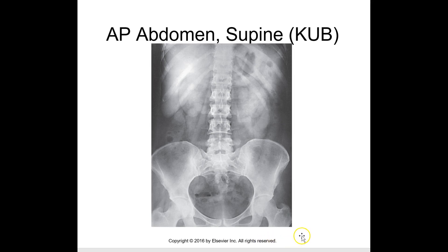Continuing with the AP, soft tissue brightness and contrast should show the lateral abdominal wall and peritoneal fat layer — the flank stripe — as well as the psoas muscles, lower border of the liver and kidneys, inferior ribs, transverse processes of the lumbar vertebrae, and right or left markers visible but not lying over abdominal contents. The example shown appears adequate with the symphysis pubis visible, but there is no marker.